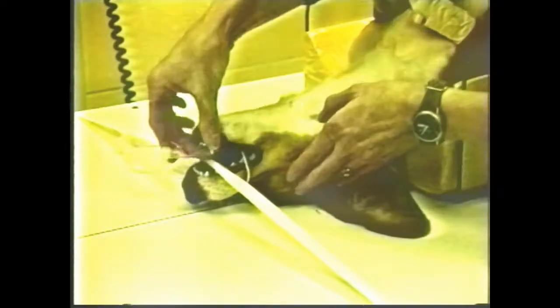This will show a demonstration of intraoral radiographs using various types of film. In this particular case, the film is placed inside the mouth so that there is no superimposition of either the maxilla or mandible, whichever the case may be.